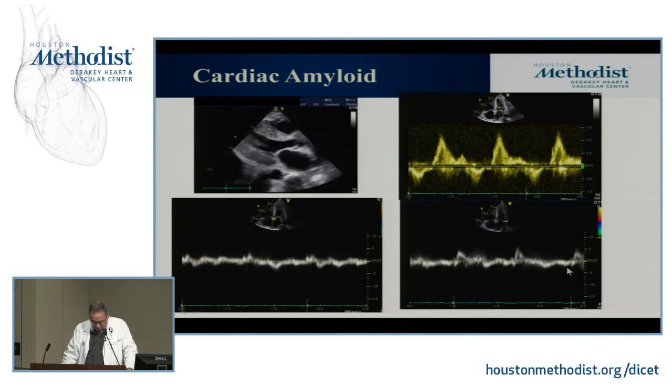But the very important thing here is that you have a discrepancy between that level of apparent LVH and then the EKG. Because the EKG may have low QRS voltage, or may just simply have low normal QRS voltage. But you're expecting an EKG with big-time voltage, and then you find something that doesn't match. That should be one of the very first lights that blink in your brain, whoops, to suspect amyloid.